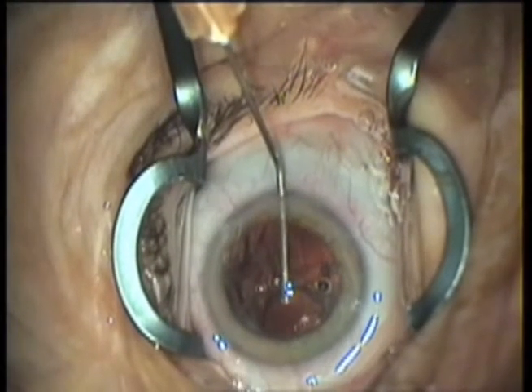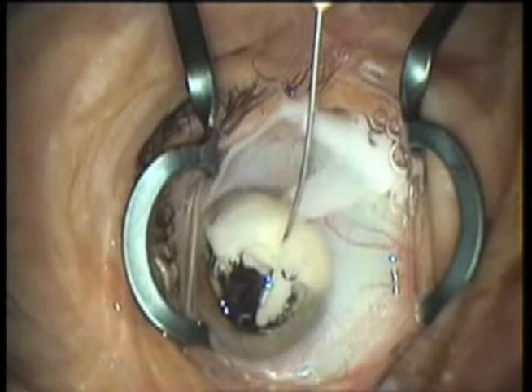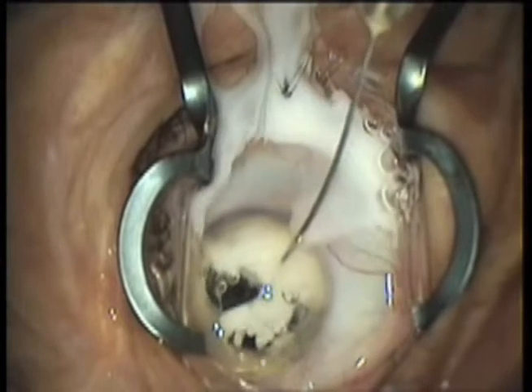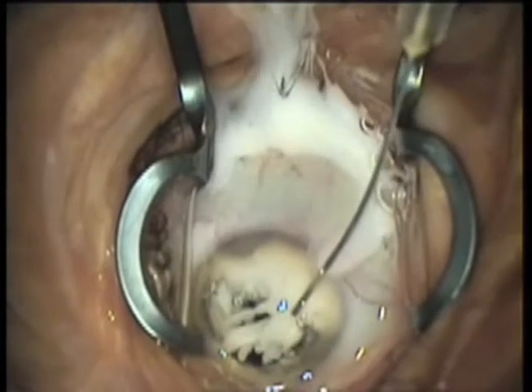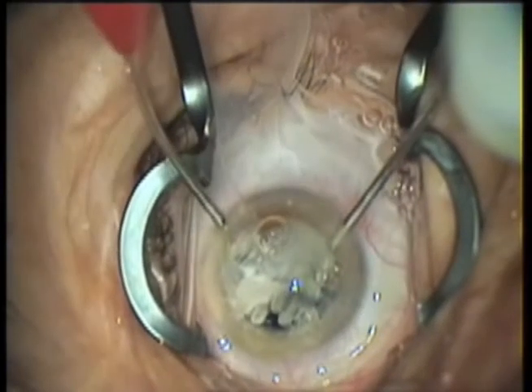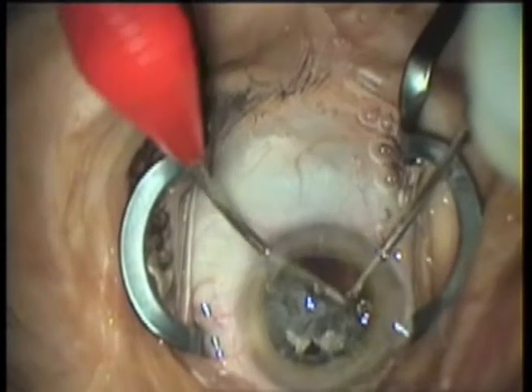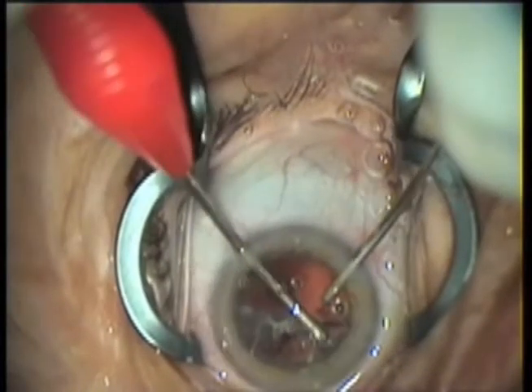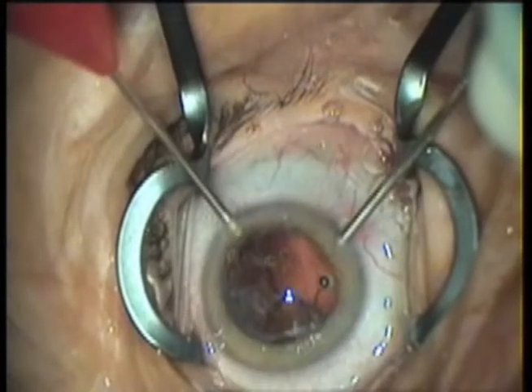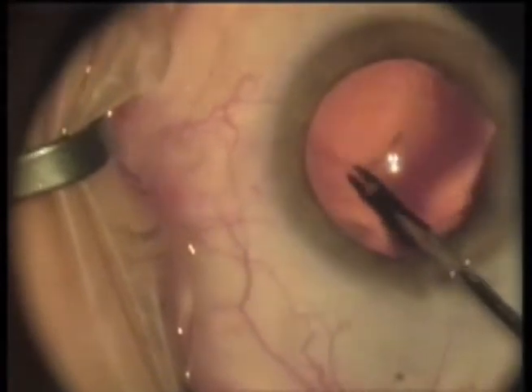Avoid these mistakes: don't inject the OVD first, as it will stain with the vitreous when you inject the triamcinolone. Don't use your irrigation-aspiration cannula to remove the residual masses and the vitreous. Don't try to do risky manoeuvres like posterior capture to place a lens inside the bag. Try to be simple.